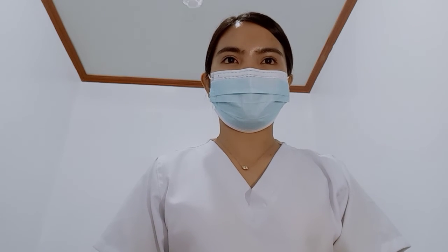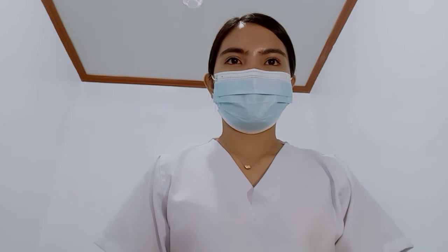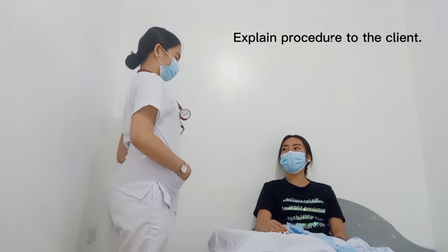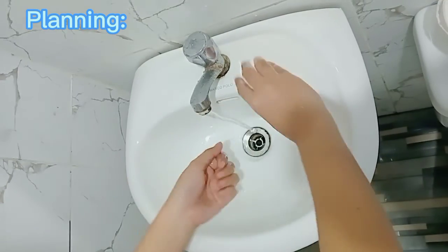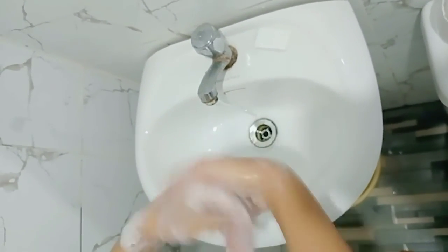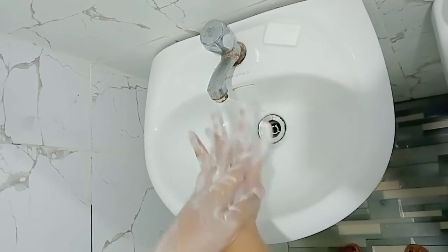blood pressure apparatus, sphygmomanometer, stethoscope, paper and pen, cotton ball soaked with alcohol. Okay, Mom, I'm going to check your blood pressure. Is that okay with you, Mom? Yes, nurse. Okay. For planning, wash your hands to prevent the transmission of microorganisms and gather all the equipment needed.